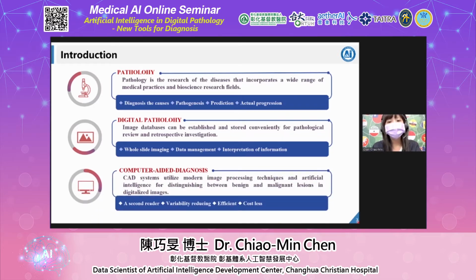But the huge volume of patient information increases the stress on pathologists and decreases efficiency. To reduce the negative impact and challenge, computer-aided diagnosis was proposed to handle the huge image data. CAD systems utilize modern image processing techniques and AI, whether for diagnosis, abnormal region detection, or segmentation. Computer technology implements the pathologist's experience in biomedical characteristics and automatically reduces routine tasks.